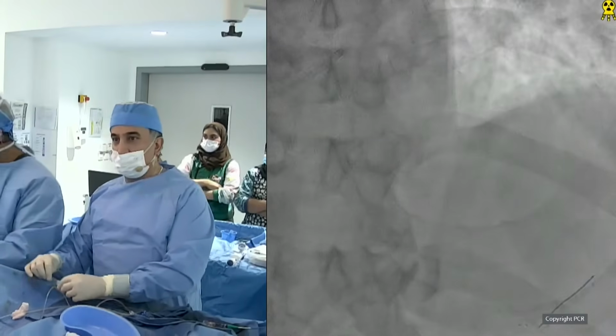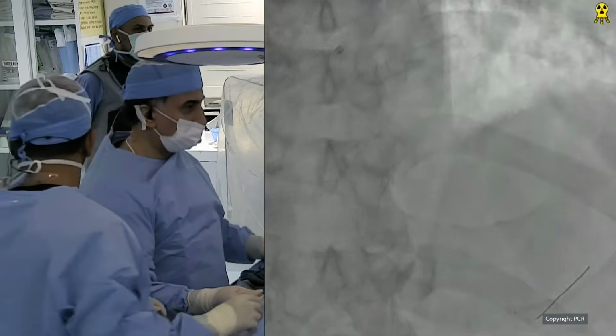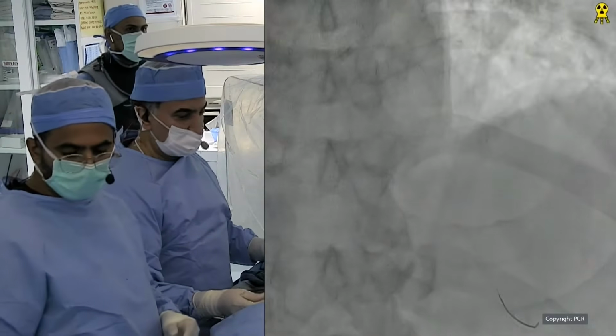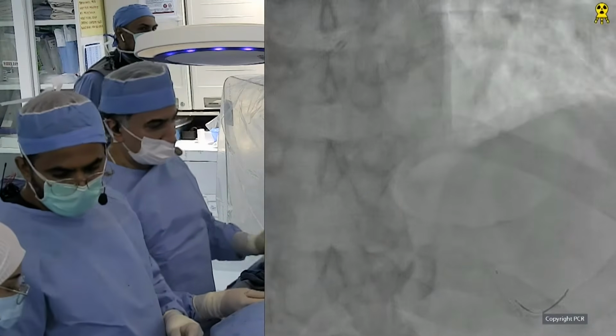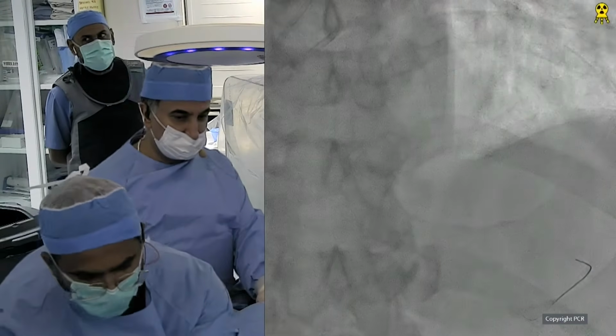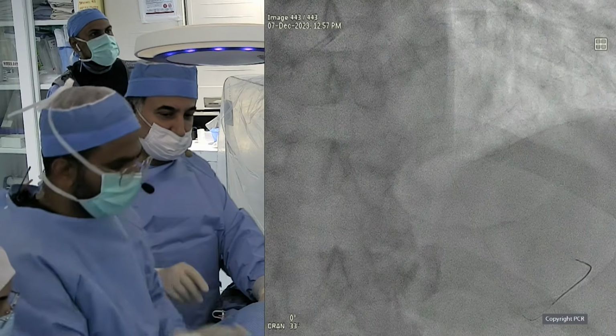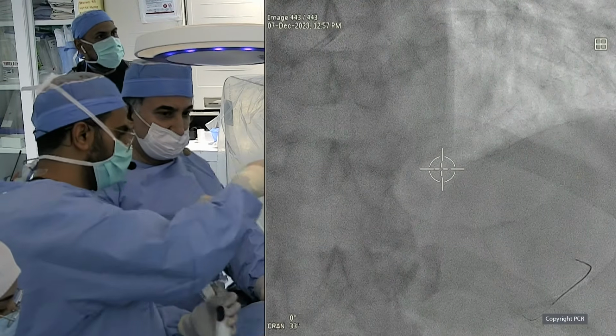And we are going to take measurements about the effectiveness of this very small burr, because we do not expect it to have a very big lumen, and we need to plan the strategy. So basically the size, the length, that's the usual, but also the choice of the next tools and devices. Excellent.